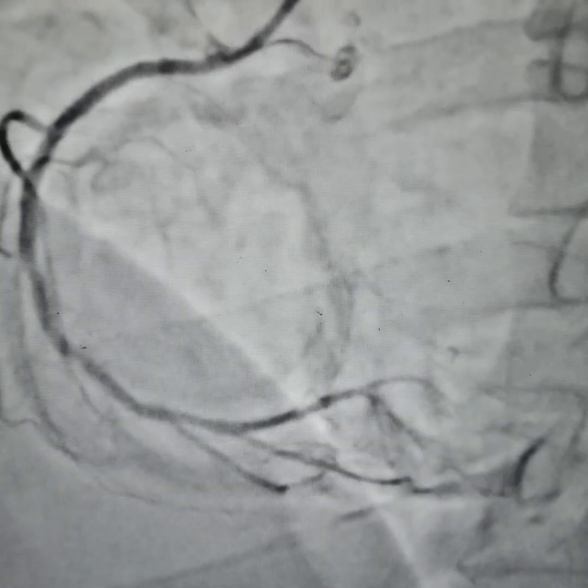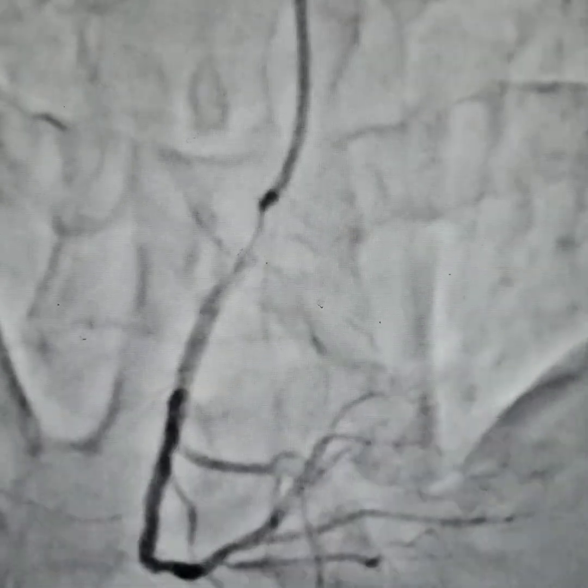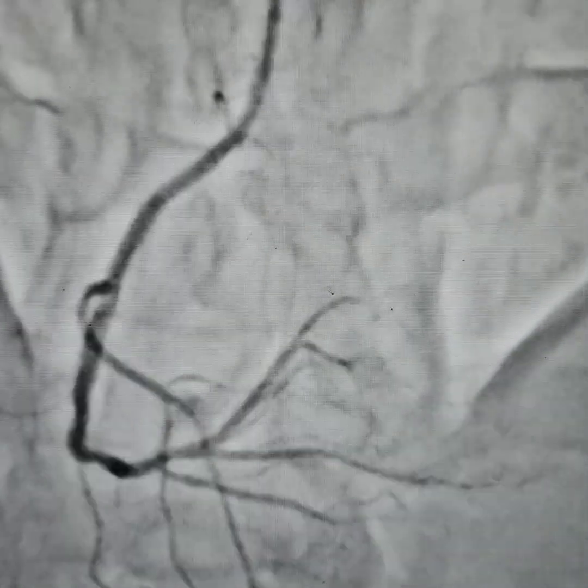On the tightest portion, dilatation was done with a 3 by 12mm NC balloon, inflated for about 20 to 30 seconds each time at 16 to 18 ATM of pressure, with a very good result. The patient was pain-free at this time. Thank you.